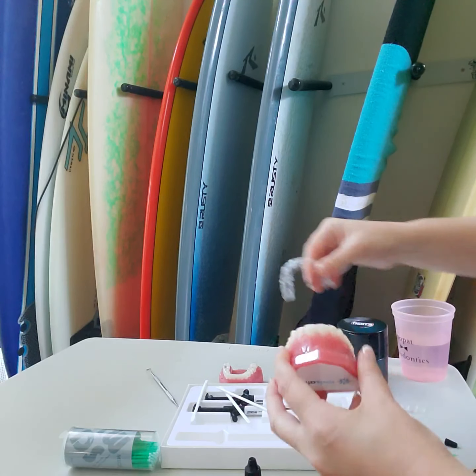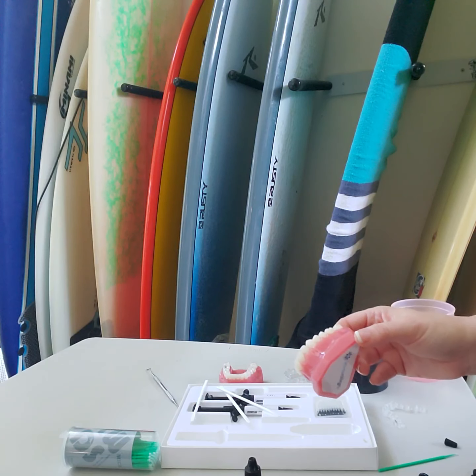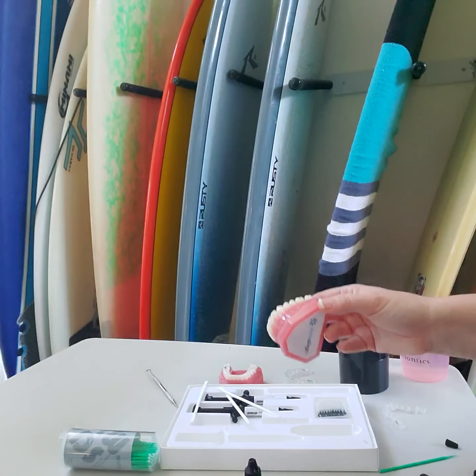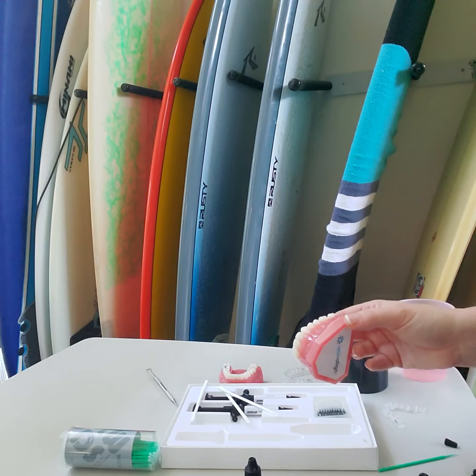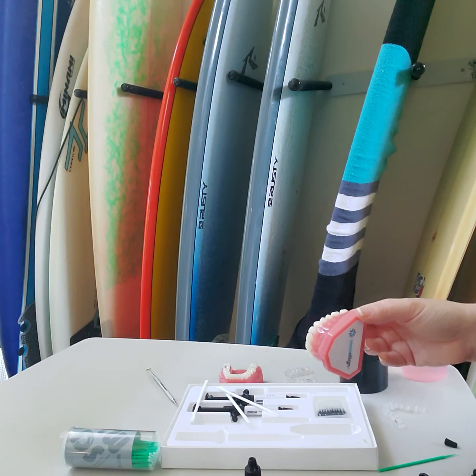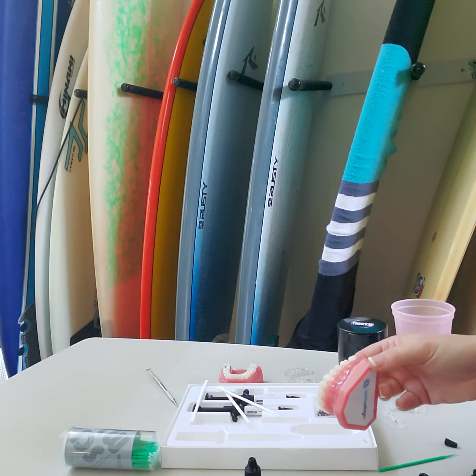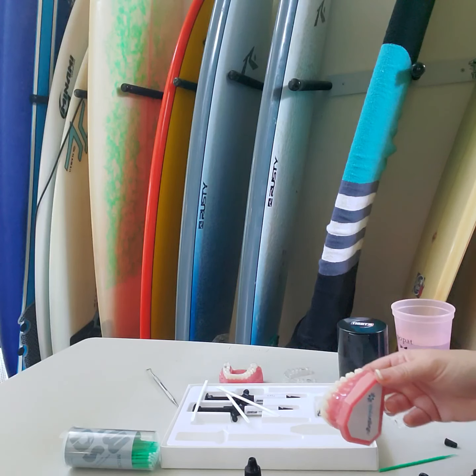And then you're going to count your attachments again. Make sure that you have the right amount of attachments on each arch. That's pretty much it. That's how you put on attachments. It's not that hard. If one comes off when you peel it off, it's not a huge deal. Get out your handpiece, smooth it off, make sure you got all the stuff off, and just do that one again, okay? You should be able to just use the template again.